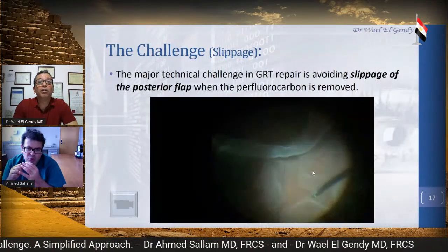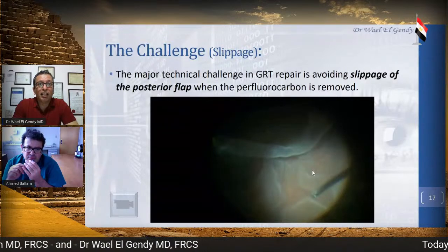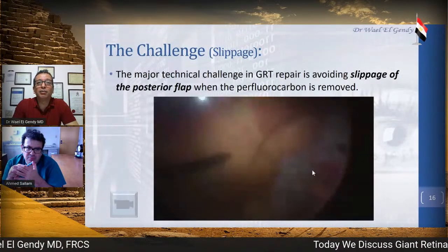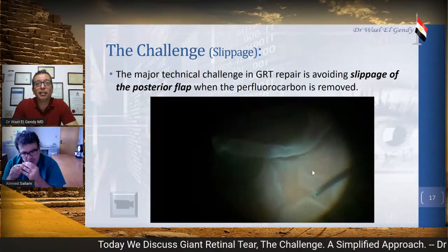Okay, so let's go to the next. What did you do in this case, or what did the surgeon do? Well, in this case, we did another row of laser. Another row of laser. Okay.